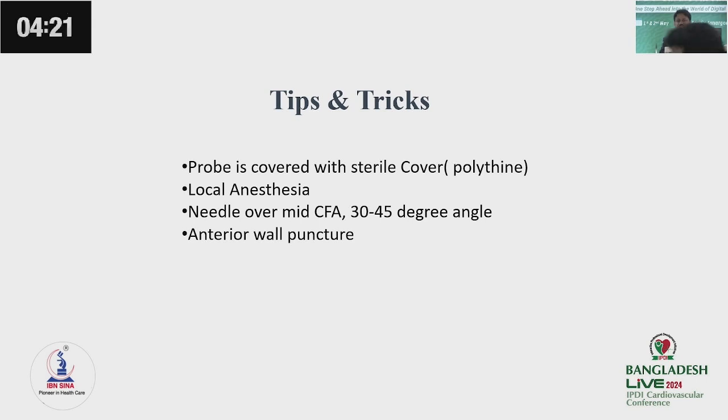The tips and tricks for ultrasound guidance: the probe is covered with a sterile cover such as polythene, local anesthesia is given, and the needle is placed over the mid common femoral artery at a 30 to 45 degree angle, and the anterior wall should be punctured.